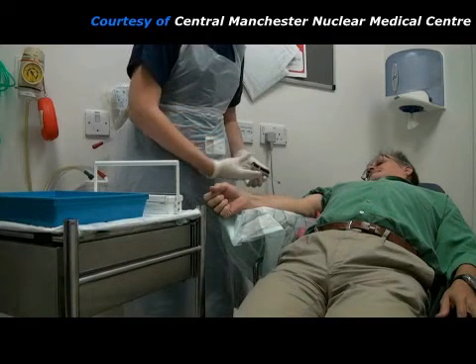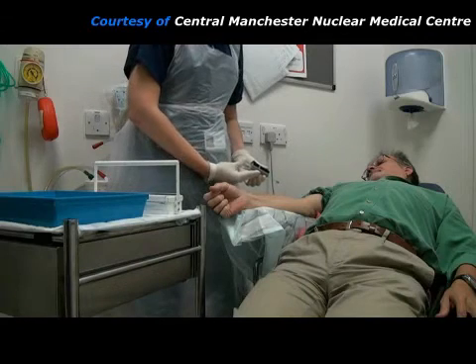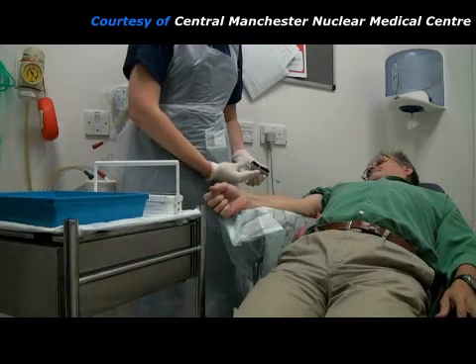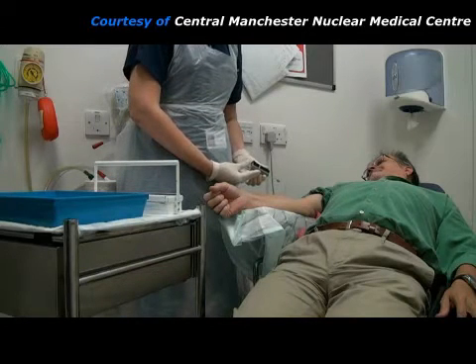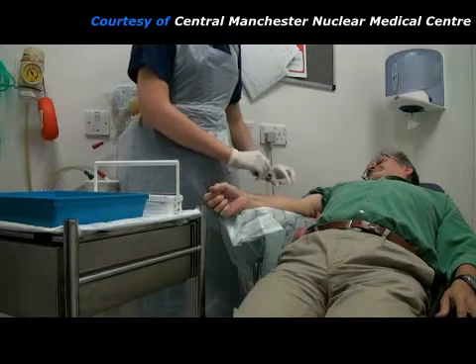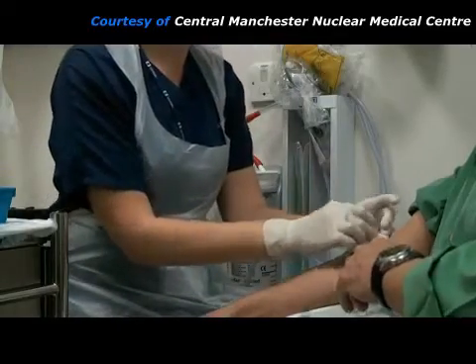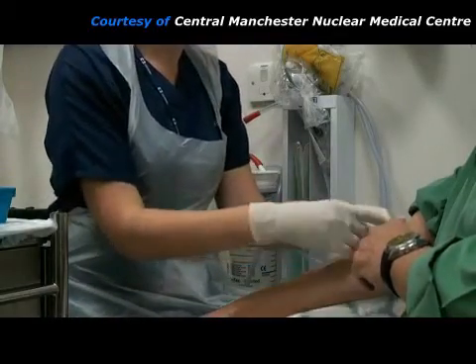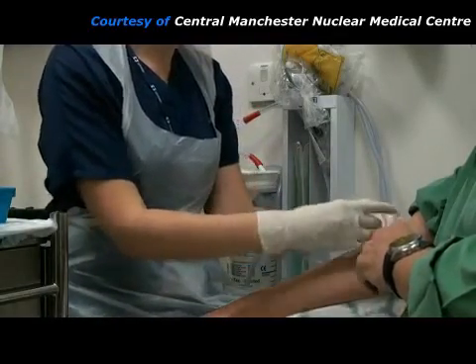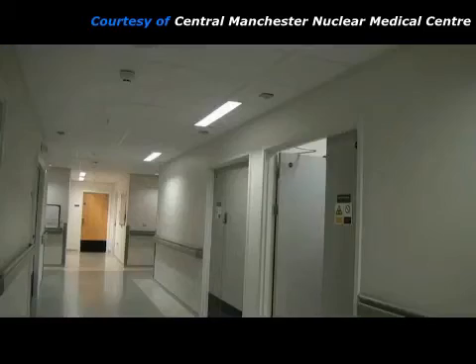This injection is called a radiopharmaceutical and it contains small particles of protein with a radioactive marker attached to them. These particles stick in the patient's lungs, showing if there are any blockages to the lung blood supply.